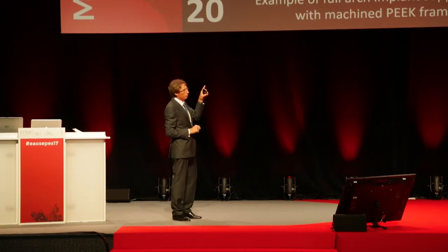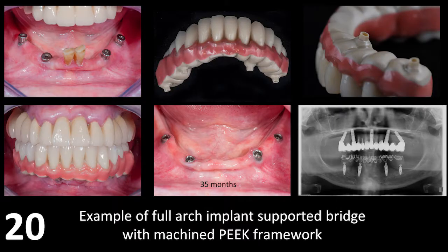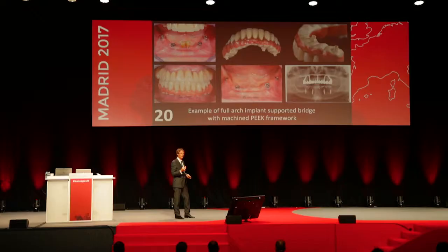And you see that we now not only do the PEEK abutment in cases of multi-unit abutments, but we do it directly into the internal hex of the implant. And so sometimes if we have a slight disparallelism between the implants, these bridges go inside because we can click them in because of the elasticity of the PEEK. And also we do these cases of the directly machined implant hex. We have no screw loosening, no screw fracture, and these PEEK hex resist perfectly. We have no wear there.